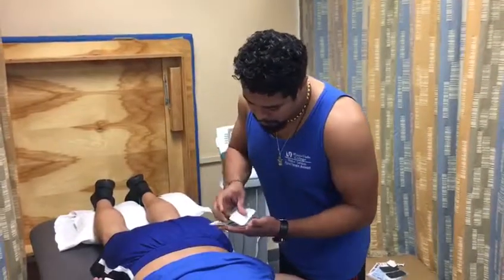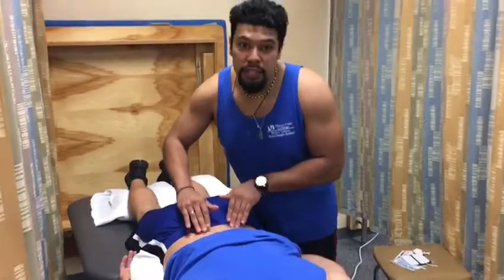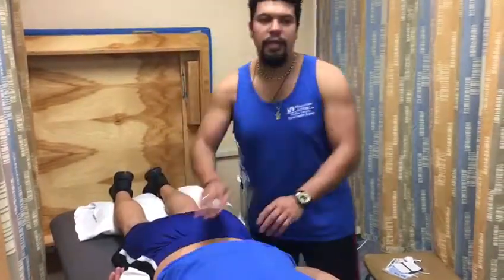How are you feeling, Daniel? Fine. All right, very good. Any pain? No. Any discomfort? All right, reassess the skin, make sure nothing is red. You feel my fingers? Yep. Very good, and that's electrotherapy.